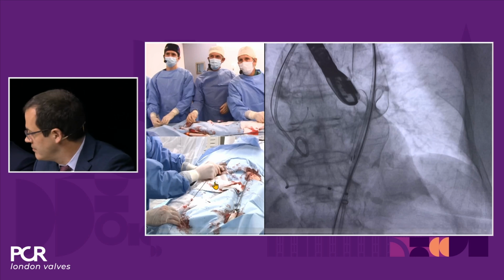Maybe also one comment as emphasis for the audience that this is an additional axis, but you can integrate the pigtail, that you would otherwise need an additional access route for. So you can use this. How do you do the closure? Do you use Angio-Seal, ProGlide? One Perclose. That's what we've been doing as well. One single Perclose. Yep.